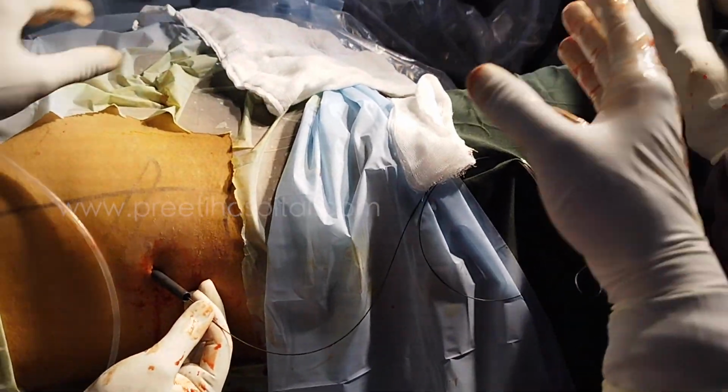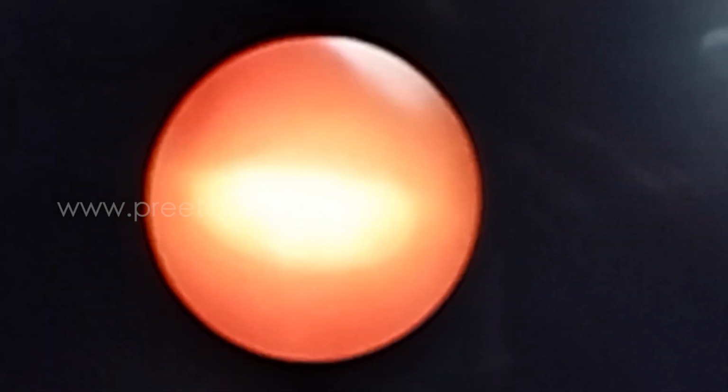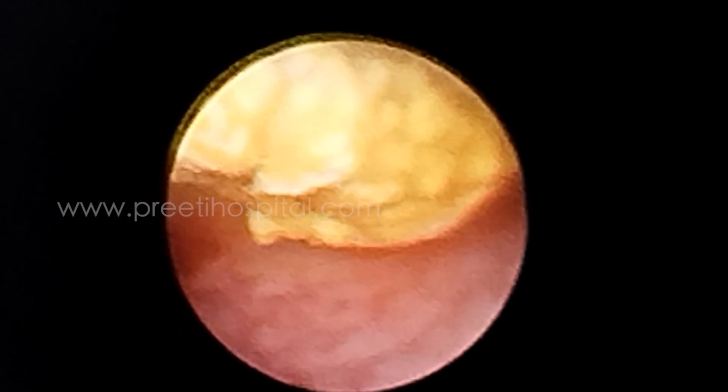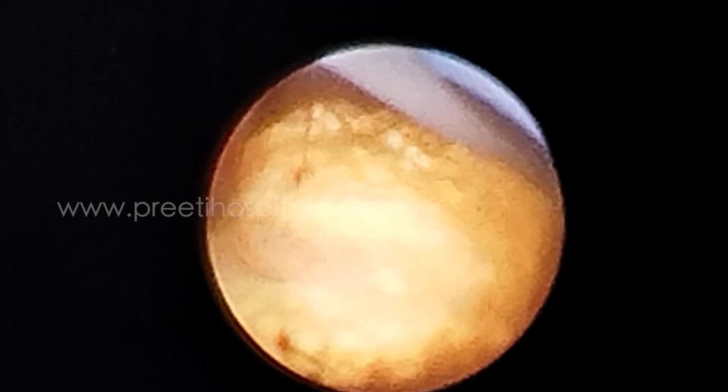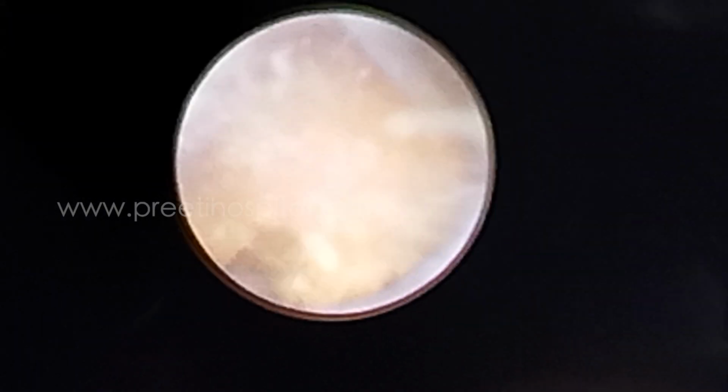Scope itches. Now this proper recording of this. After this there is not much. See now, absolutely there is no problem. You got the point? See, this is the entry of the calyx, and this is the infundibulum, and this is the pelvis. Okay. Now this you pass like this, because the tip of the calyx has not been seen. Now you can use the pneumatic. Pneumatic, please. You make pieces in supine PCNL and at the end take out also, no problem.